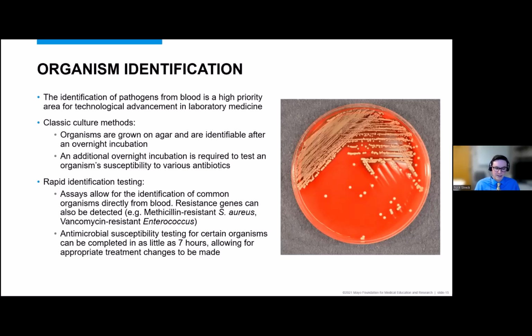There are also new assays that can provide more information on susceptibility testing, can actually provide a limited susceptibility profile in the same day that the bottle flags positive, rather than waiting for actual growth of the organism. There are a few different methods and technologies that have been implemented in laboratories that can do that as well. So in the same day that a blood culture is positive, the microbiology laboratory now has a lot of tools that can get this information out very, very rapidly to help impact patient care as soon as possible.